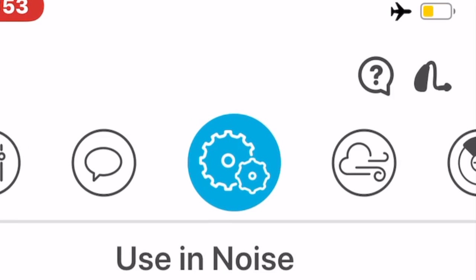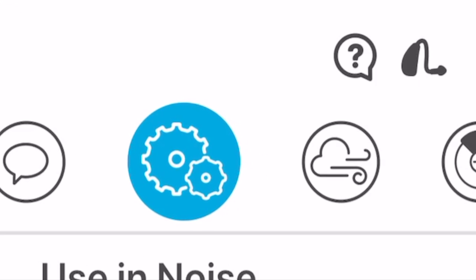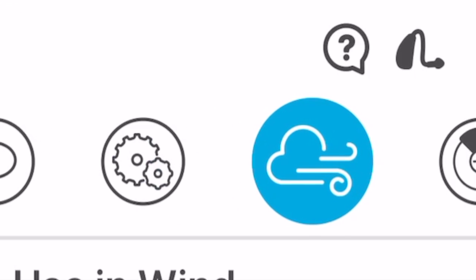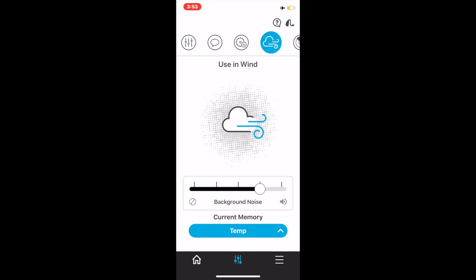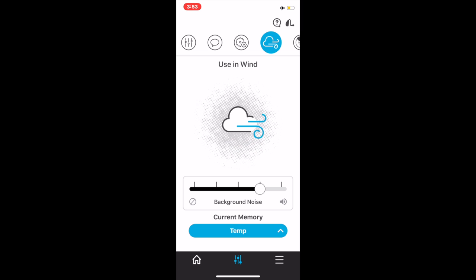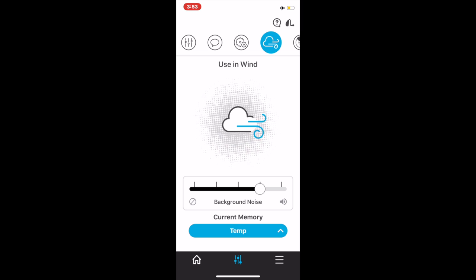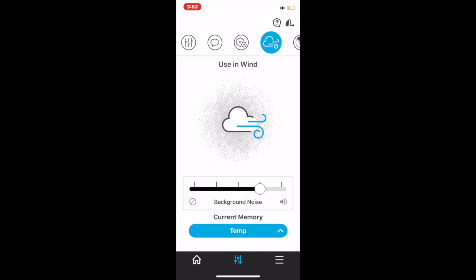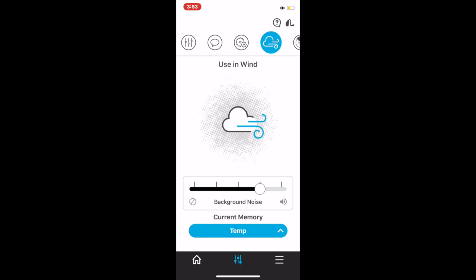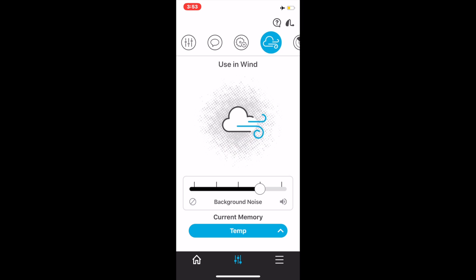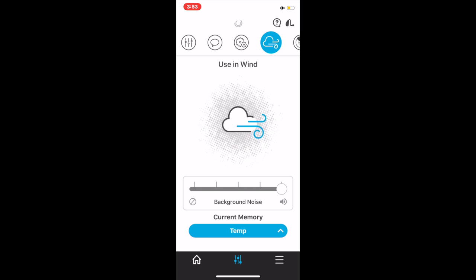Again, looking up at the top, you'll see the wind icon. This provides control for reducing the sound of wind noise blowing across your hearing aid microphones. Again, moving it to the right will provide more comfort in a windy environment.